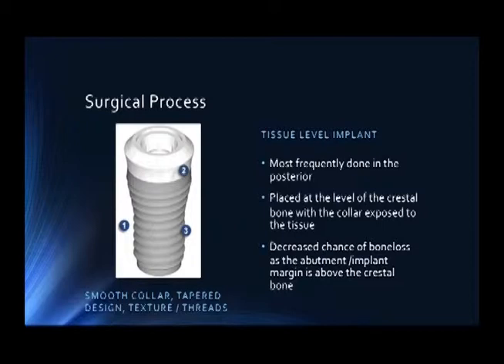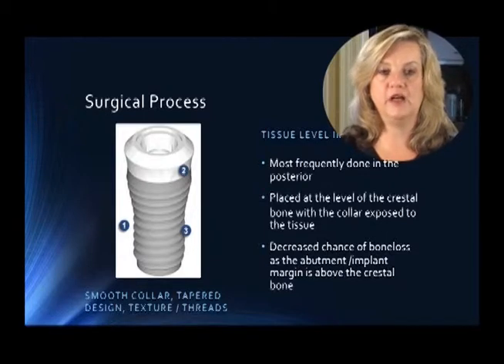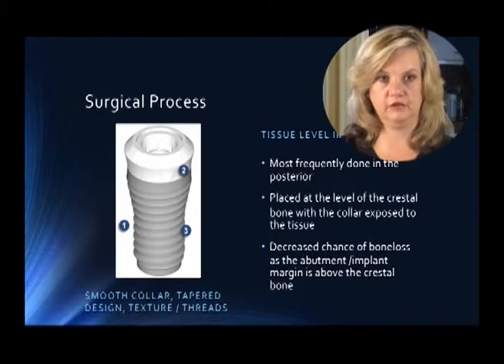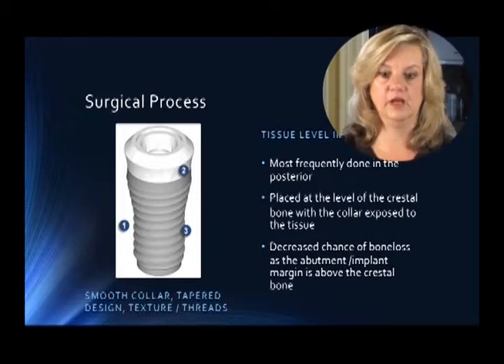All implants have threads and are textured. The ones that are more textured, think of it like a stuccoed ceiling. I think I talked about that before, that it just gives you more surface area when it's more textured for the bone to integrate into the implant.